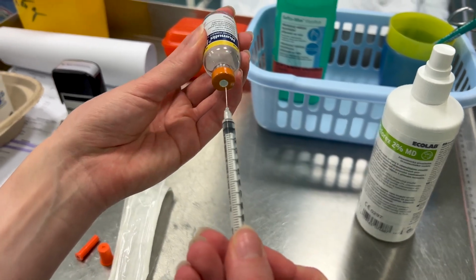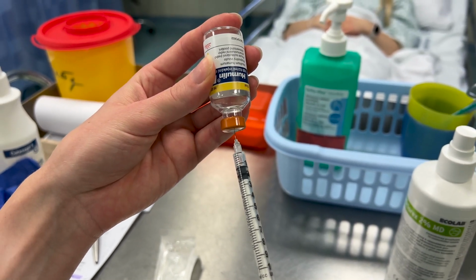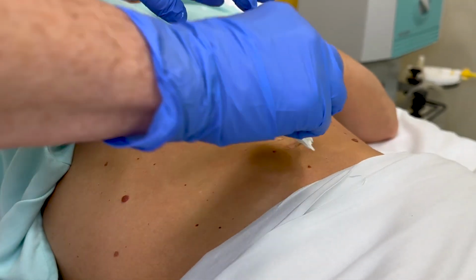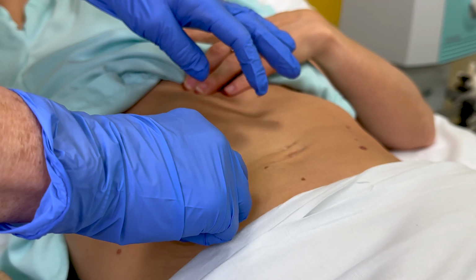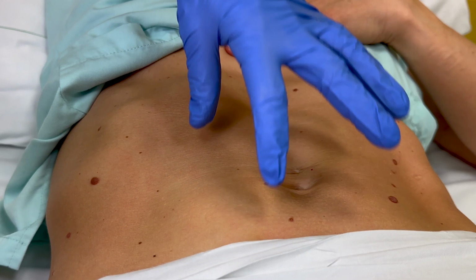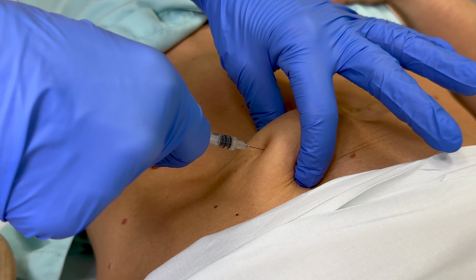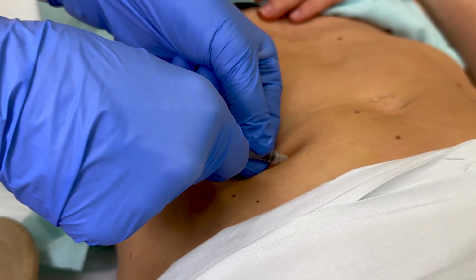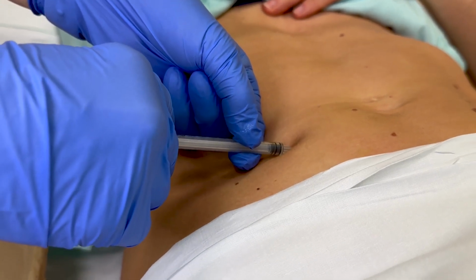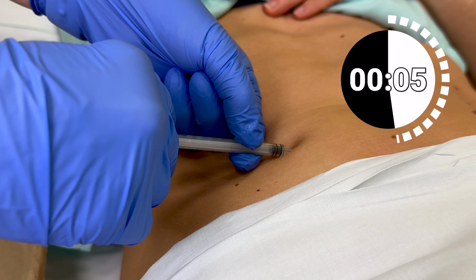Draw insulin into the insulin syringe, leaving approximately 0.1 milliliters of air. Check the number of units drawn into the syringe. Disinfect the injection site. Create a skin fold with the non-dominant hand. Perform the injection at an angle of approximately 45 degrees. Release the skin fold and with the hand that was holding the fold, stabilize the syringe cone. With the other hand, aspirate. Slowly inject the insulin, including the air bubble.